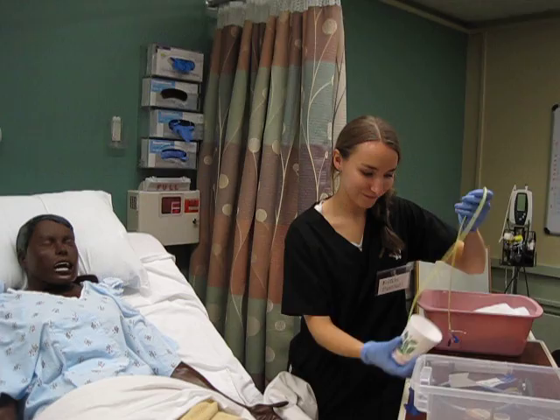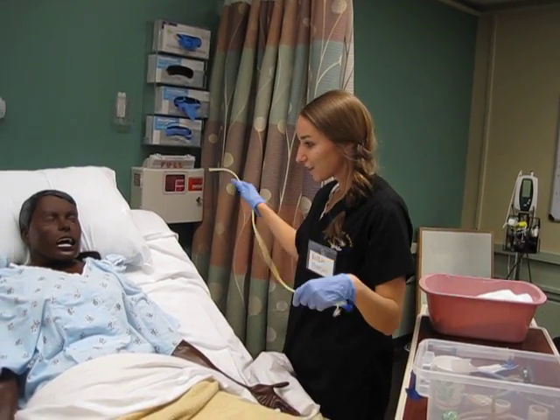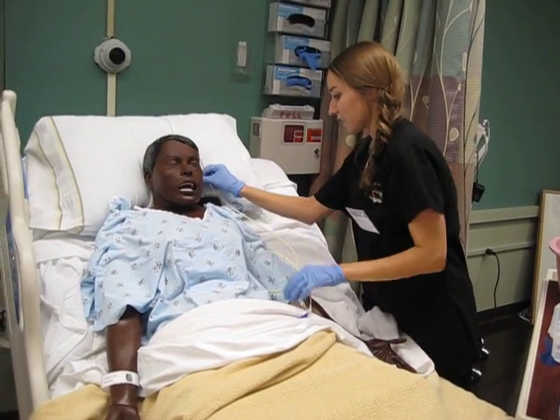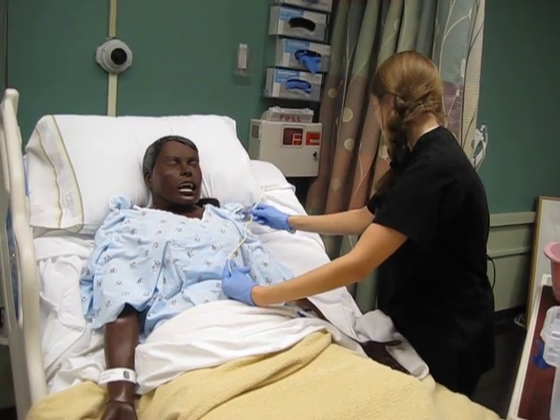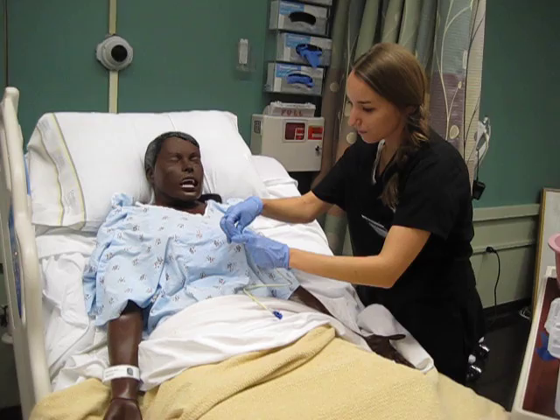I'm going to measure the tube for you just to make sure that it goes the right place. I'm going to mark that off.